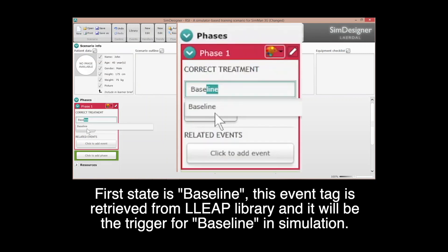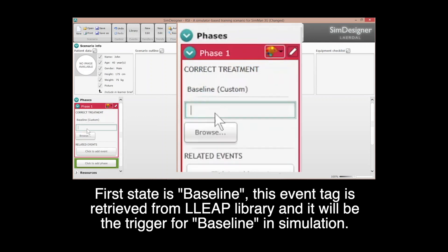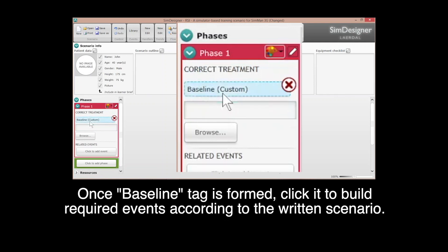This event is retrieved from the LLEAP library and it will be triggered for baseline in simulation. Once baseline tag is formed, click it to build required event according to the written scenario.